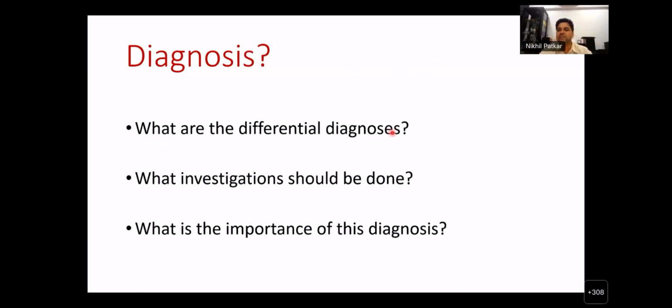So what are the differential diagnoses here? Sir, the first differential diagnosis will be acute myelomonocytic leukemia. But it is ruled out from the cytochemistry. All the cells are showing positive myeloperoxidase. So perfect. The differential diagnosis of such a case should be a monocytic leukemia, but the morphology is really classic. The problem is there are no granules. If you don't have access to an MPO stain, you will be in trouble, because you can make a confident diagnosis once you see the MPO.